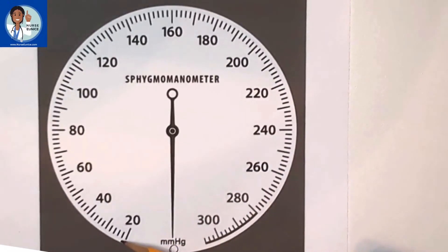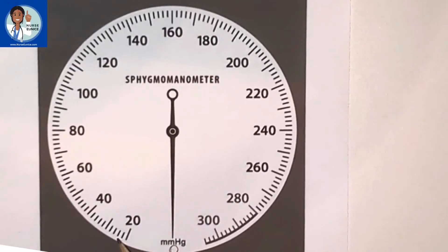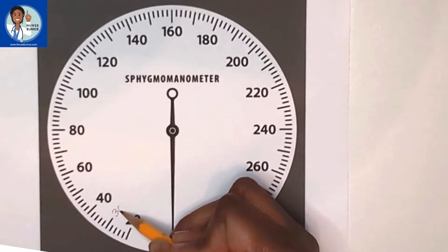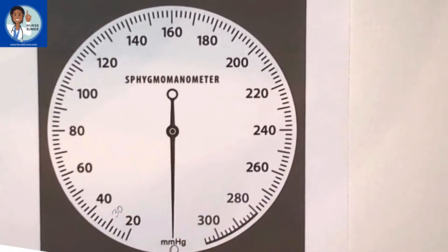Here we go: 20, small line above would be 22, two small lines above 20 is 24, 26, 28, long line with no number would be 30. Let's keep it going: 32, 34, 36, 38, 40.